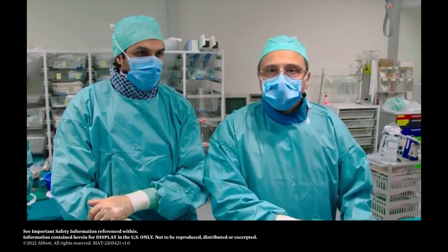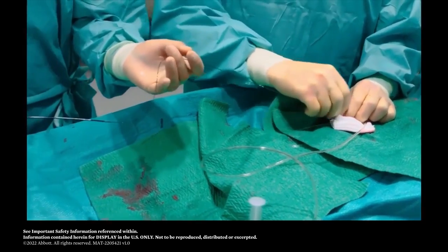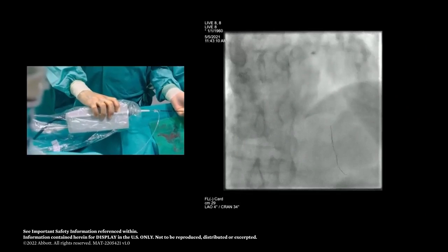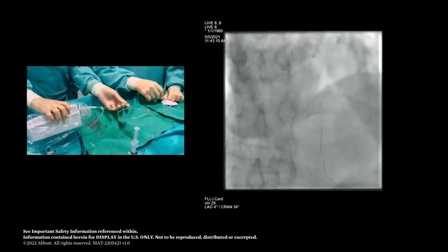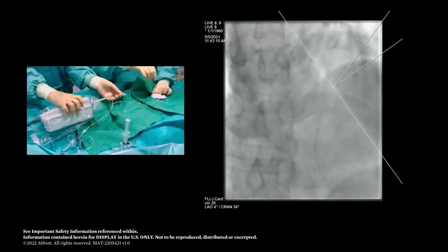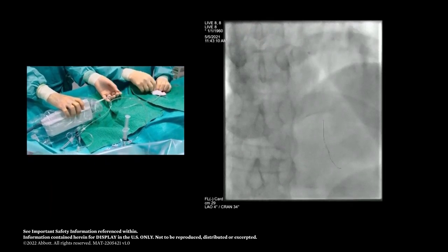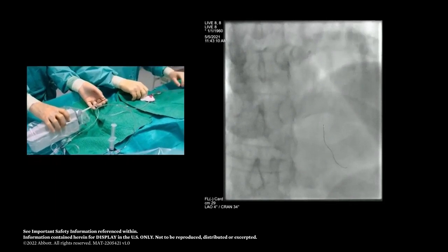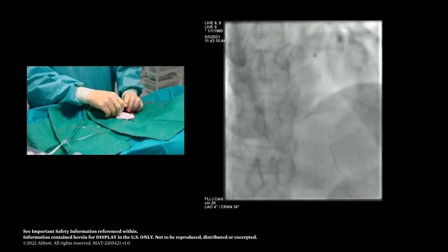So we are ready with the OCT assessment. The wire is already in. The OCT catheter is on the wire. Let's go. Yep. It's rather calcified and tortuous, so I hope the OCT catheter will slide through, Carlos. If not, we will need to do some. You see already we have some buckling of the device. I'll pull it back a bit. It's very proximal. Yeah, indeed. But that's actually what I expected. So what I will do, I will advance the catheter a bit more and try again.